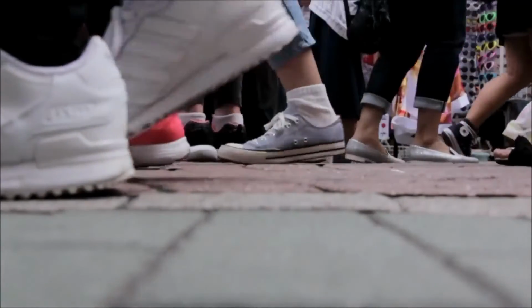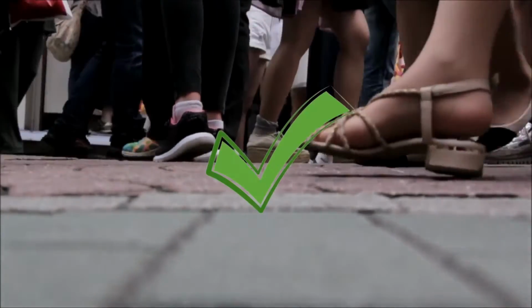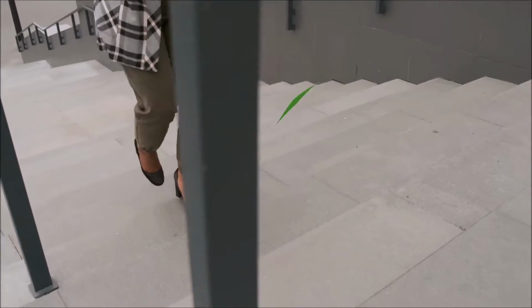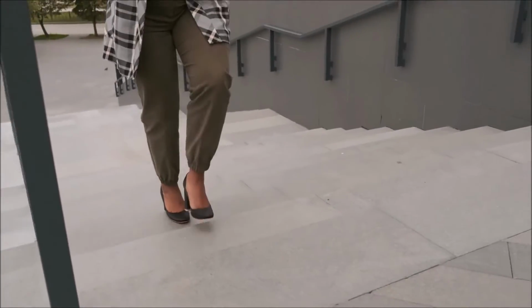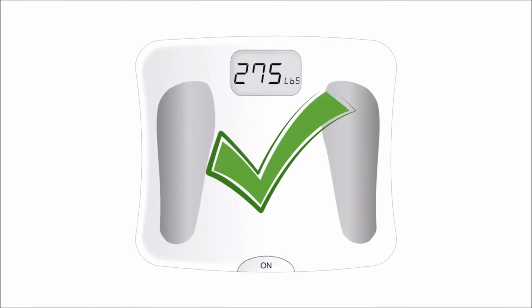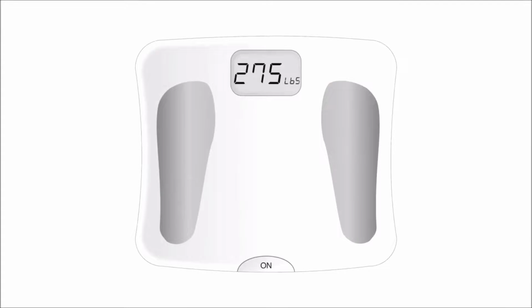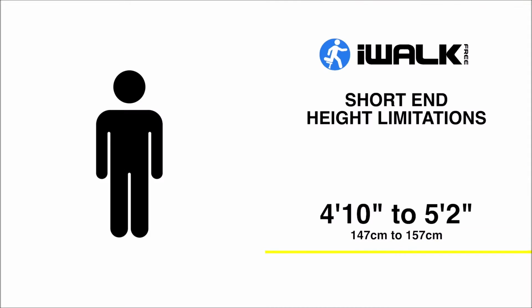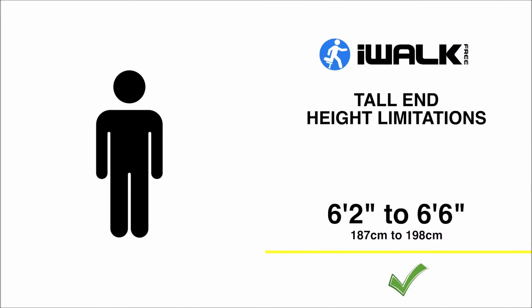Before your injury, you could walk normally without any mobility limitations. And you could go up and down stairs at normal walking speed without using a handrail. You weighed no more than 275 pounds, and you're not excessively overweight. Your height is between 4 foot 10 inches and 6 foot 6 inches.